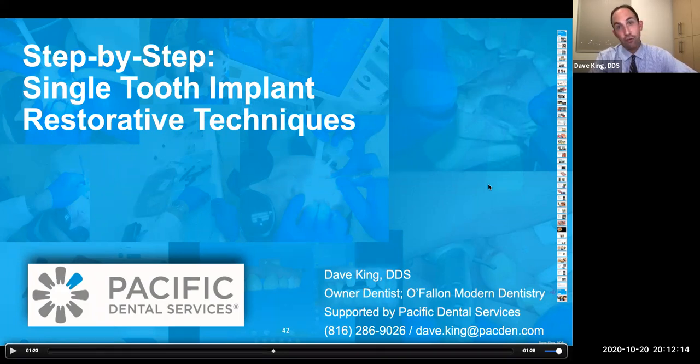Now, if we're talking about a removable prosthetic, of course 2 is usually the rule. A lot of the reason is that force is alleviated by the snap-in, the locator style or the ball style, because it allows it to move, and so there's not constant force on those implants. So yeah, more isn't always better, but sometimes it is.